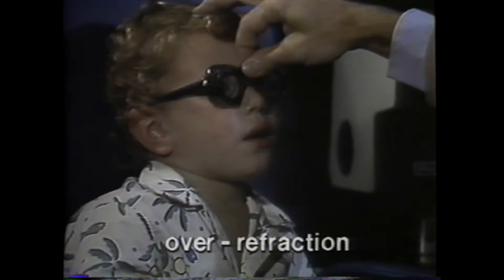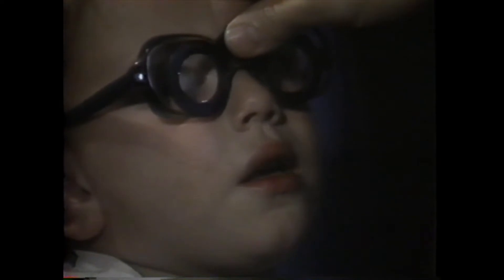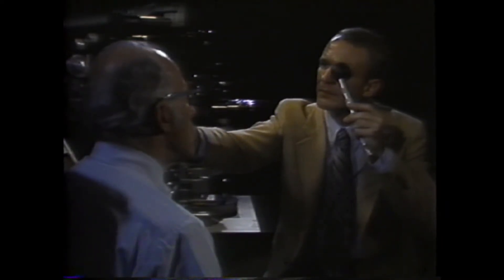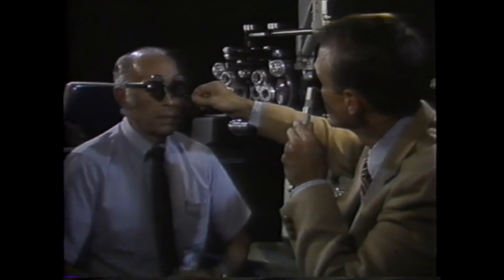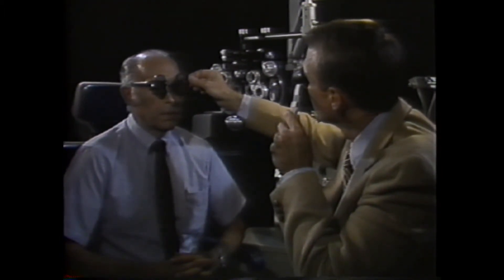One of the best time-saving applications of retinoscopy is in over-refraction. Holding up plus 1.50 spheres before a child's glasses, with the child looking at a distant target without drops, is the quickest way of confirming that the glasses are correct or close enough that they don't need changing. Over-retinoscopy can also be performed with greater accuracy of axis settings with trial lens clips on the glasses, especially useful when refracting over high-power glasses where the over-refraction technique is important in controlling the effects of vertex distance and pantoscopic tilt.